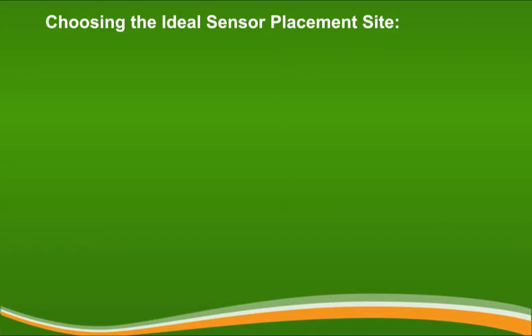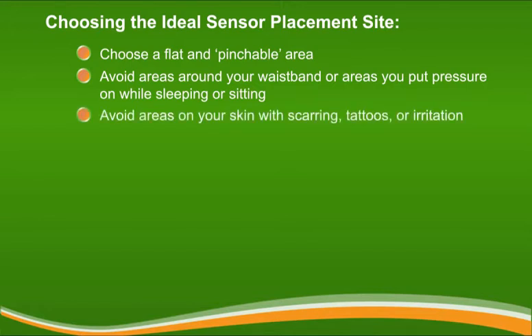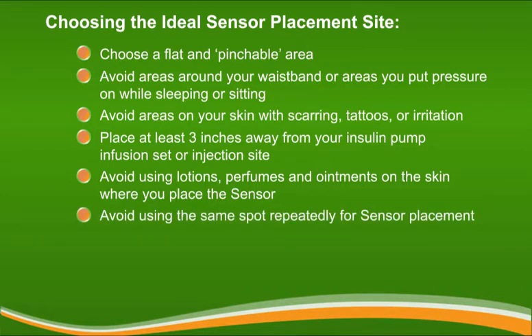When you choose which site to place your sensor, here are a few things to keep in mind. The best areas to insert your sensor are usually flat and pinchable. The placement site should be out of the way of your waistband. Avoid areas that are likely to be bumped, pushed, or pressed against, or areas of your skin with scarring, tattoos, or irritation. Place the sensor at least 3 inches away from your insulin pump infusion set or injection site. Make sure there are no traces of lotions, perfumes, or medications on the skin where you place the sensor. Change the site where you place your sensor with each new sensor.